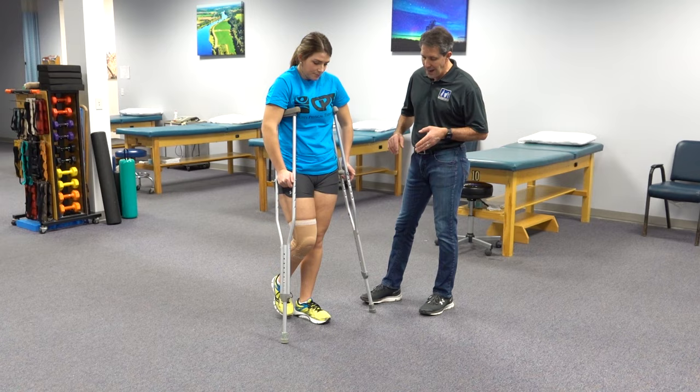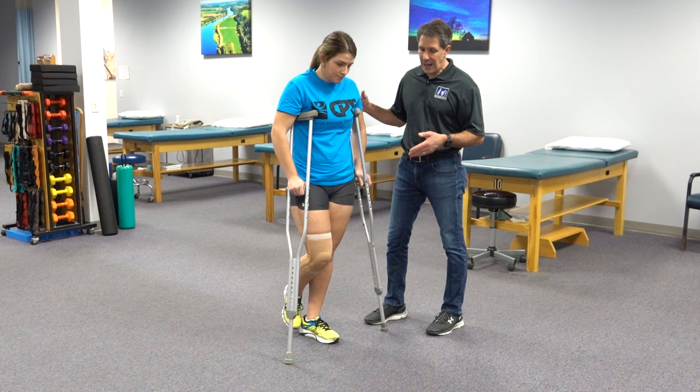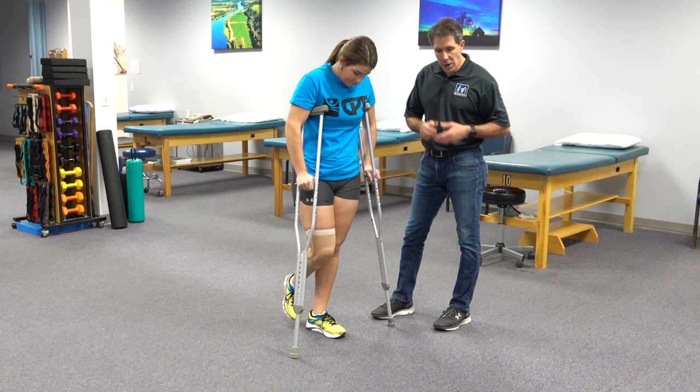It's important that when you walk you make sure the surfaces that you are on are not very slippery, so water on linoleum or ice outdoors — those are things that will cause your crutches to get away from you.